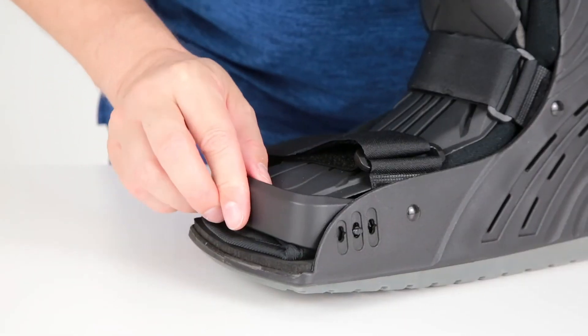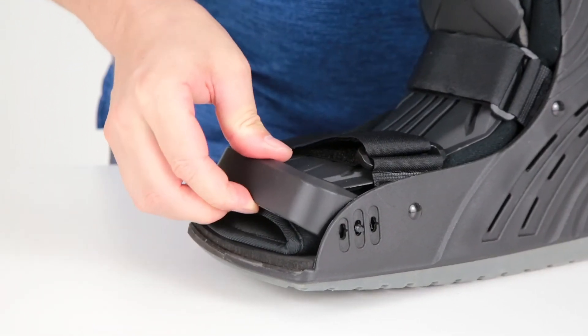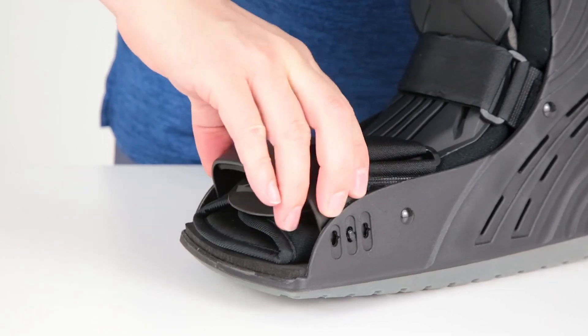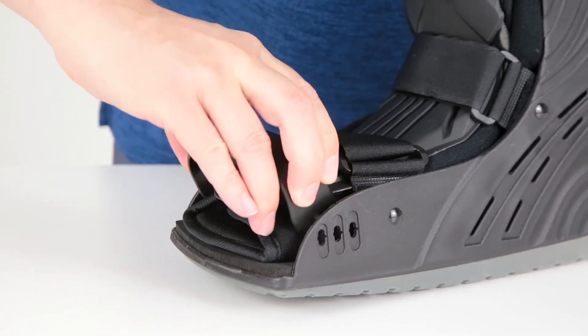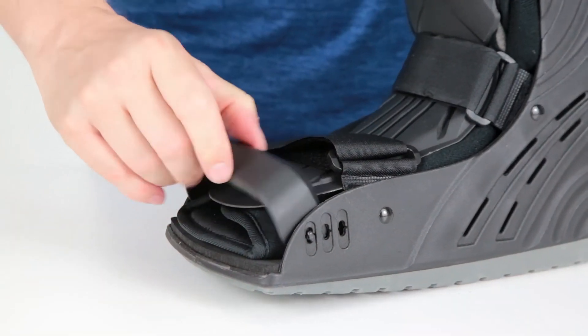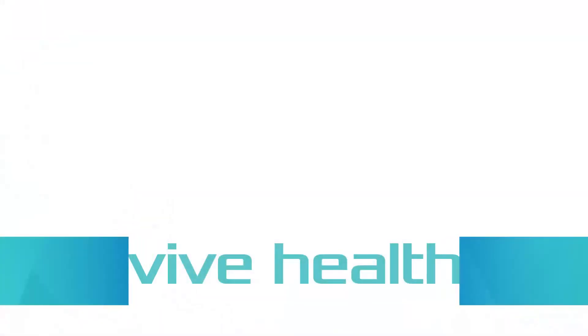To remove or adjust the toe cover, unpin the hooks on each side by positioning them vertically and pushing in to unlock. Remove the cover completely or reposition for a better fit.